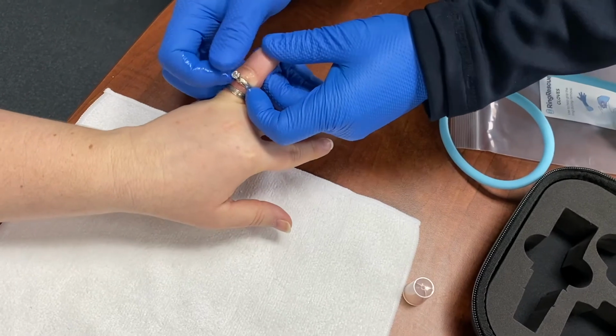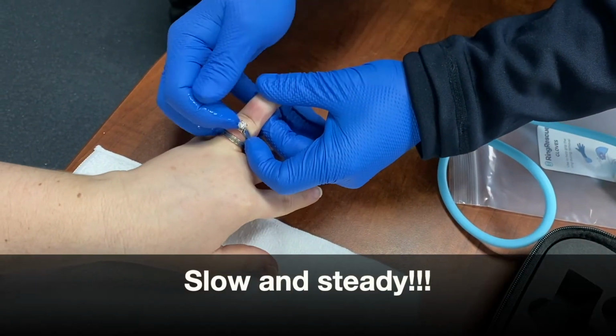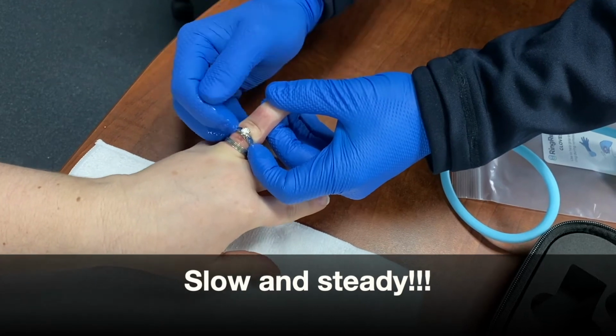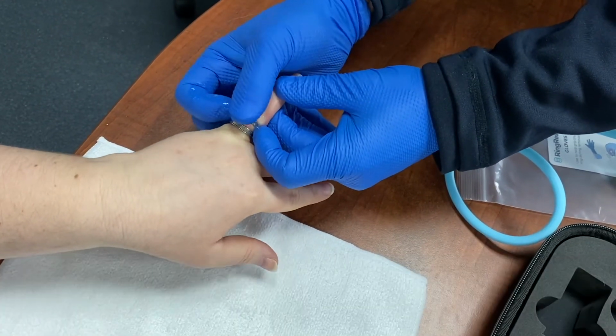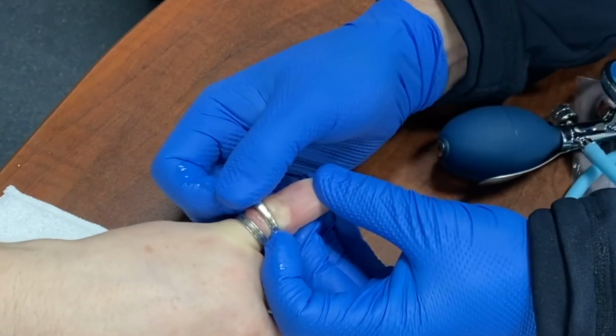Try and get over that little bit of bulge there. We're just going to go slow and steady. Yeah, it's moving itself forward, which is great. A little hard to grab a hold of. And you're still doing okay there? Great. All right. Just going to take it slow and steady.